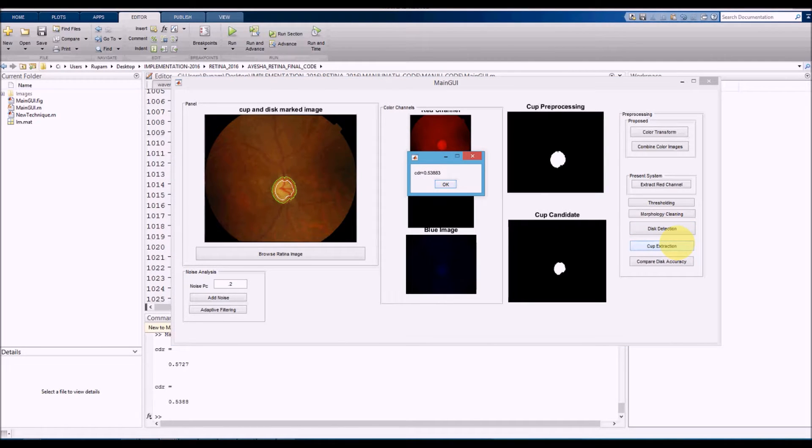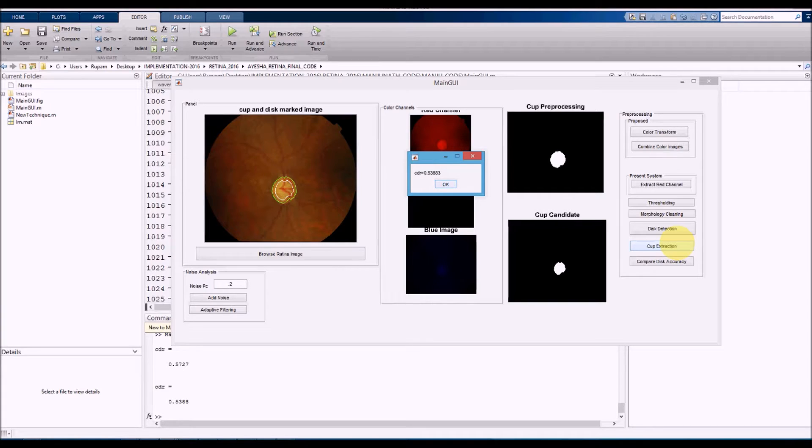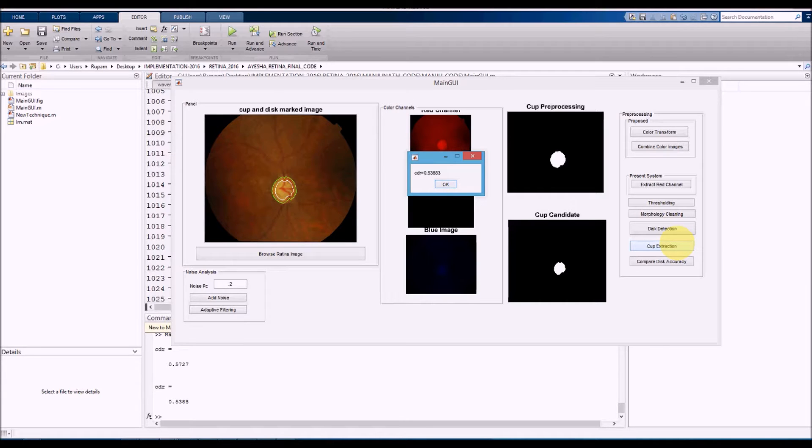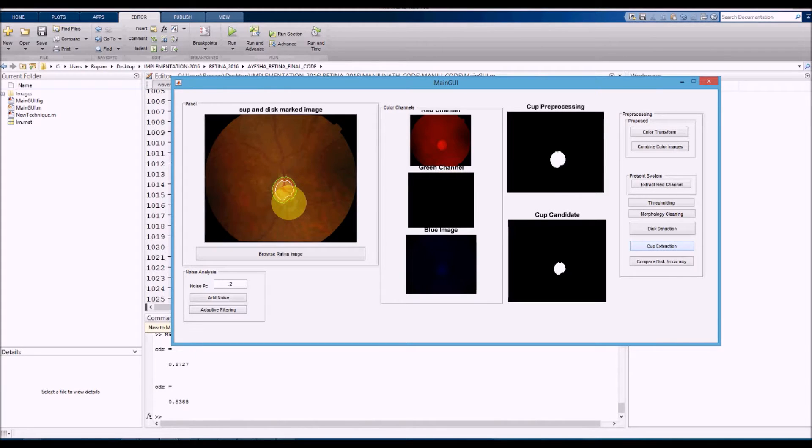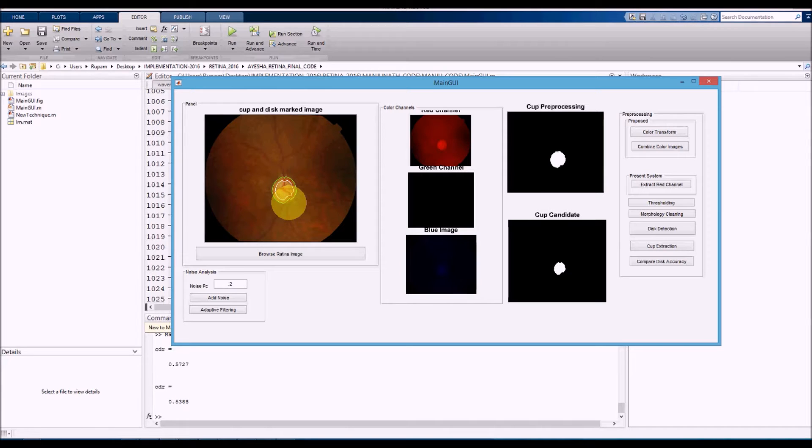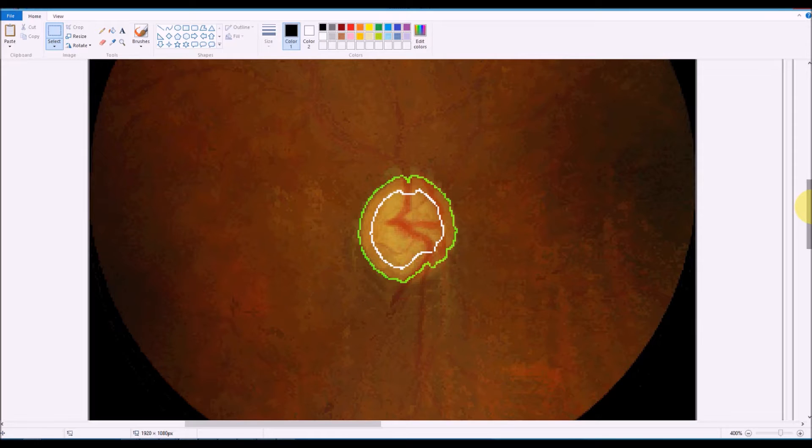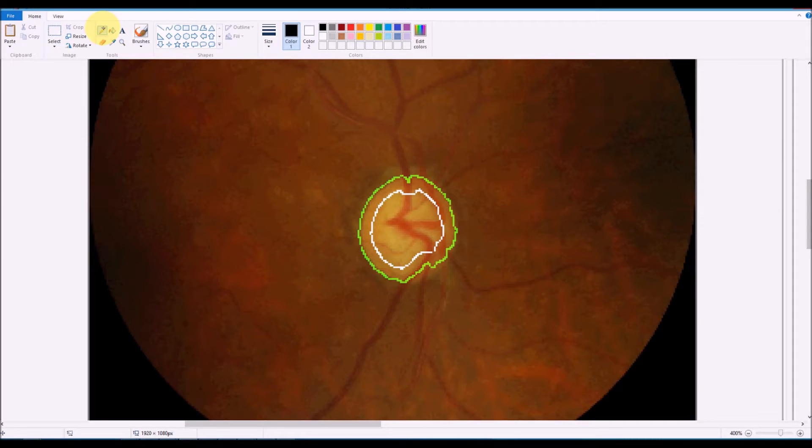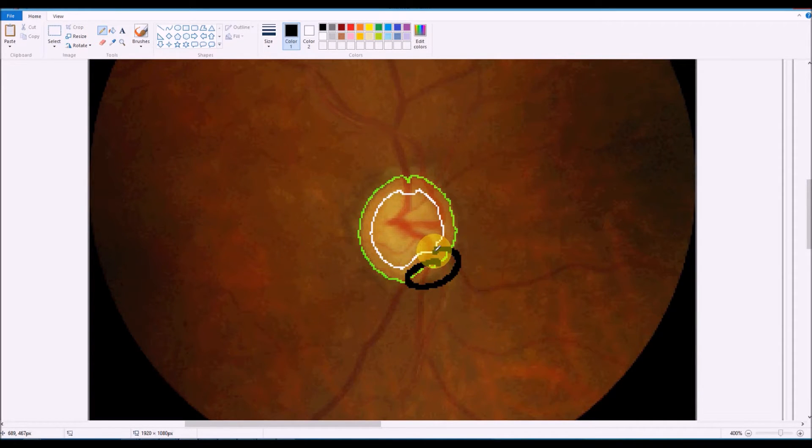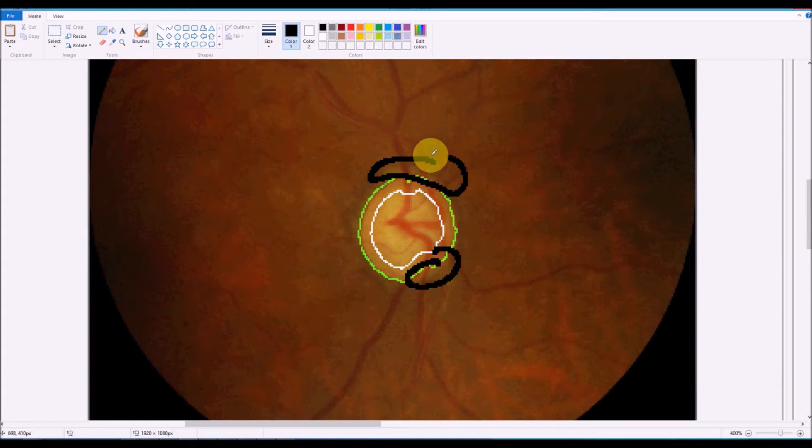The actual CDR shown earlier was about 0.58, and now it's showing about 0.53. Clearly, the disk area, if you take a screenshot and put it in paint and compare this area right here, it is not being detected by the color channel thresholding. You can also see a trace of this area which has not been detected by color channel thresholding.